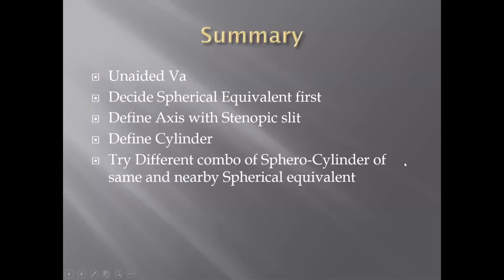So today we are going to discuss pseudophakic refraction part 2, in which I have taken a few examples of pseudophakic refraction and what points should be kept in mind to perform pseudophakic subjective testing.